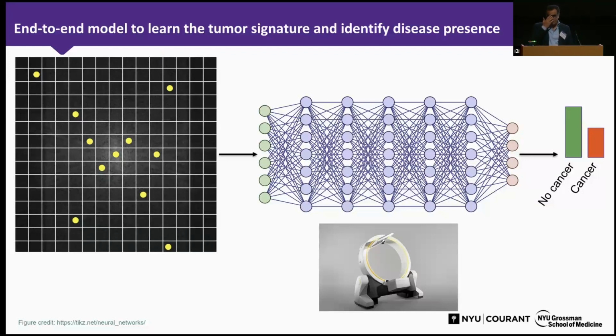And if you can do that, then basically you could use any of the scanners that Tobias and Leo are building currently, or any of the scanners that Andrew just mentioned, the extremely low field scanners, and just plug this AI model in there to give you the right answer as accurately as possible.